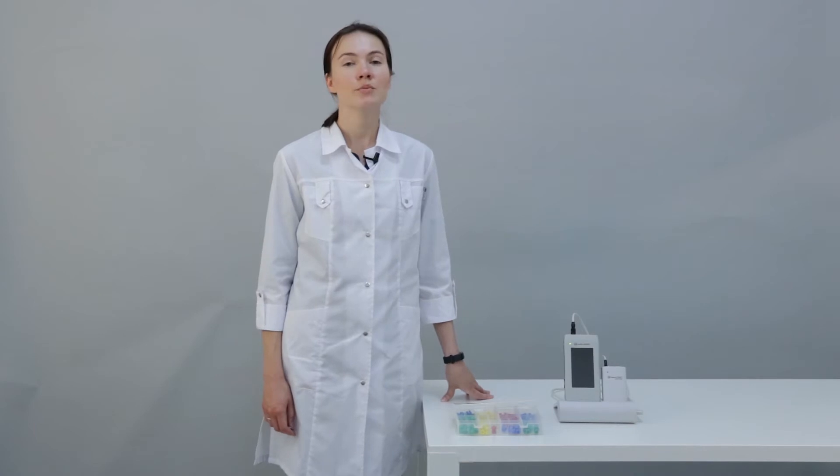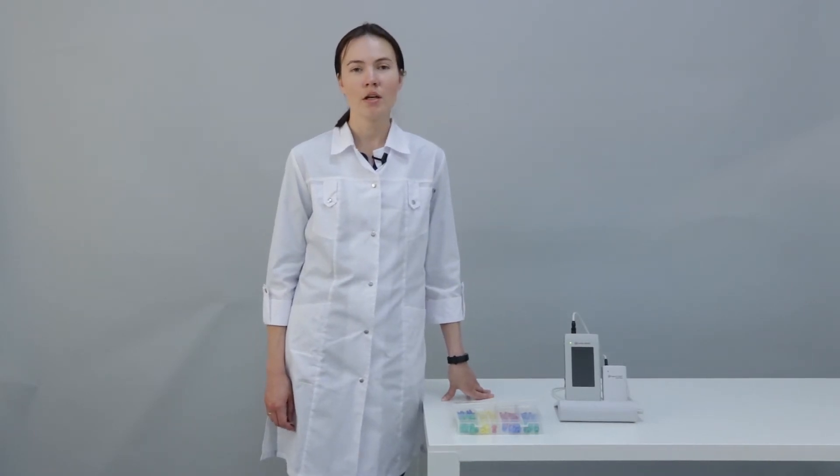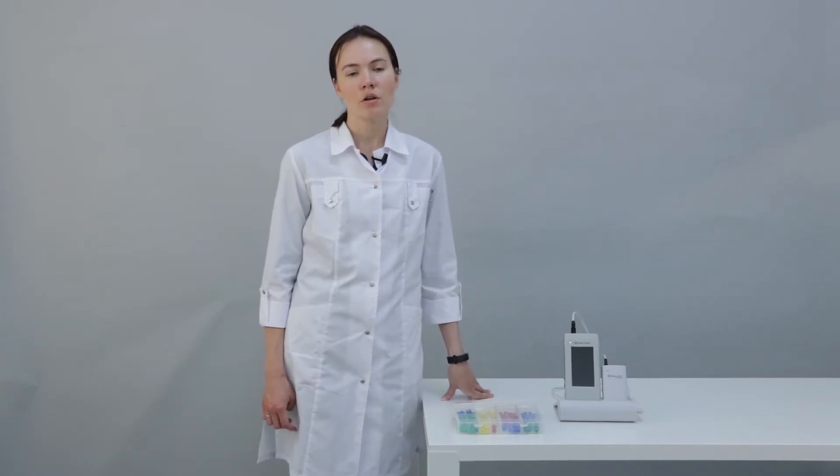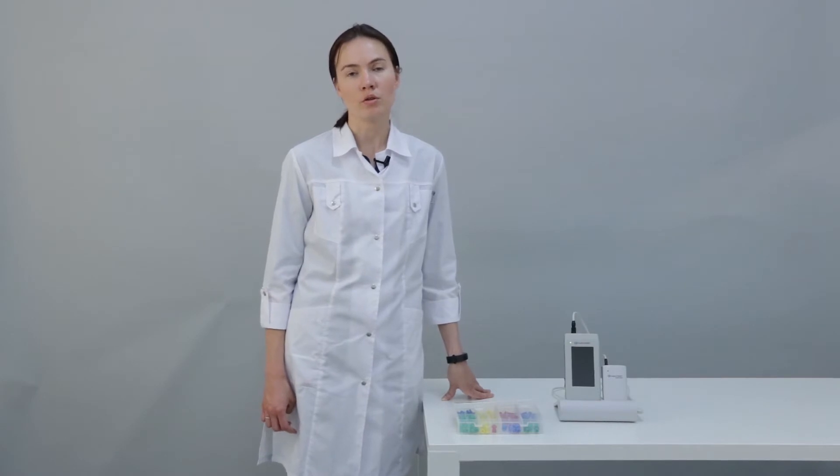Hello, my name is Maia Petrova. I'm a medical consultant of Neurosoft company and today we will perform acquisition with the help of otoacoustic emission tests in our baby.